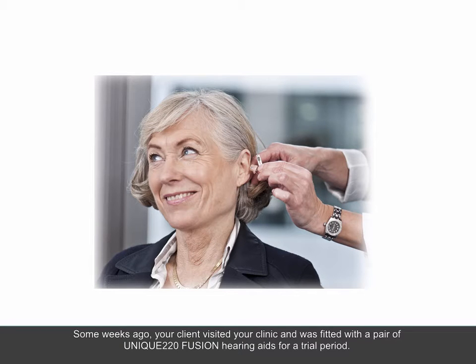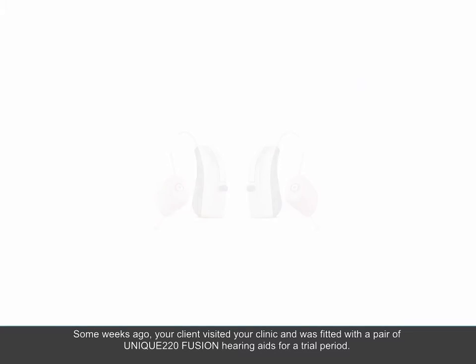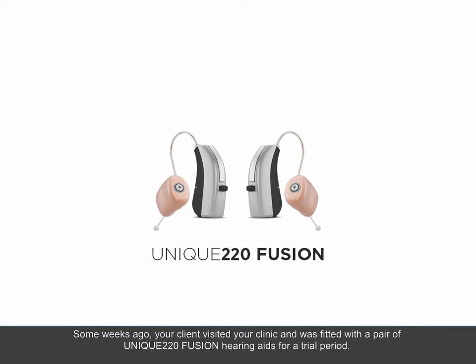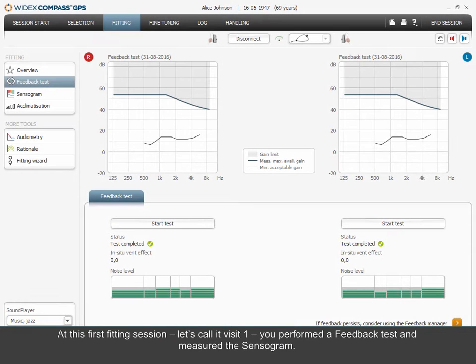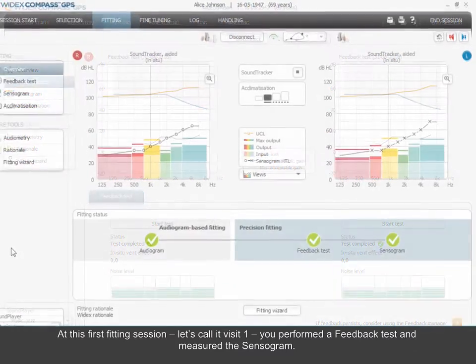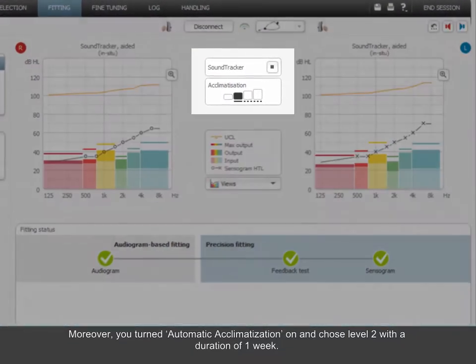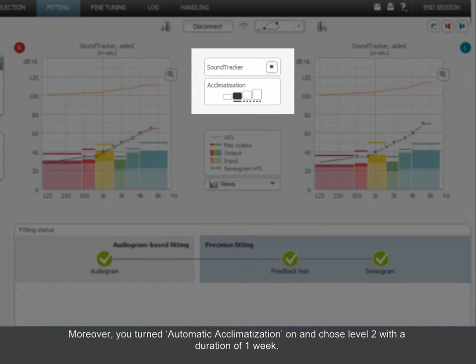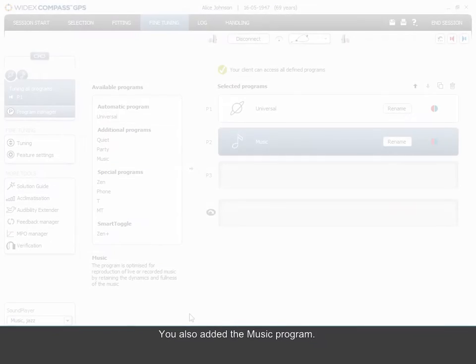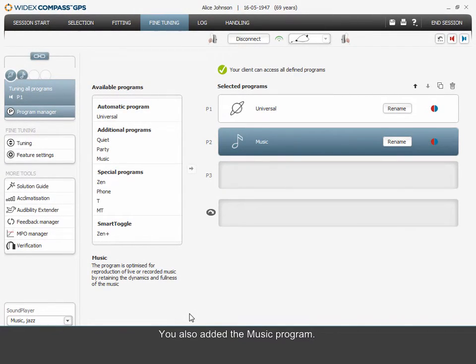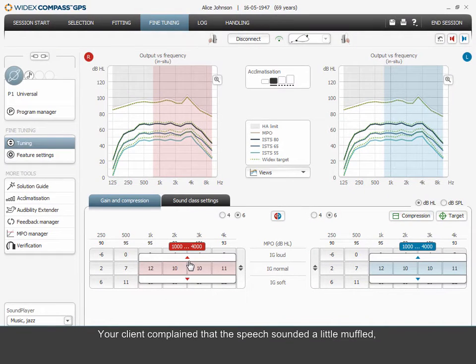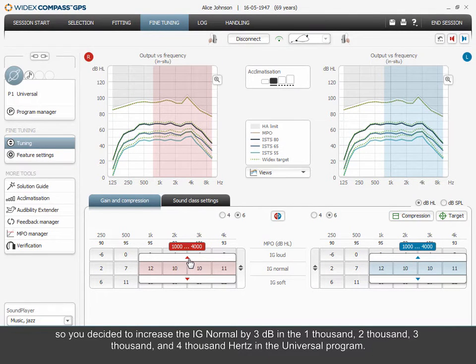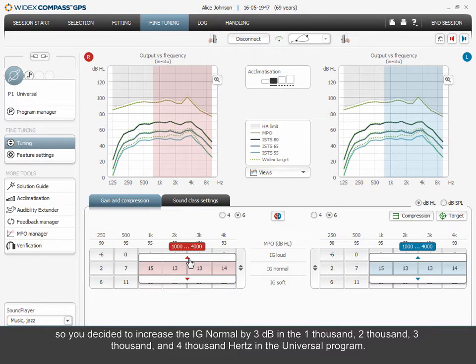Some weeks ago, your client visited your clinic and was fitted with a pair of Unique 220 Fusion hearing aids for a trial period. At this first fitting session — Visit 1 — you performed a feedback test and measured the sensogram. Moreover, you turned automatic acclimatization on and chose Level 2 with a duration of one week. You also added the music program. Your client complained that the speech sounded a little muffled, so you decided to increase the IG normal by 3 dB in the 1,000, 2,000, 3,000, and 4,000 Hz in the universal program.